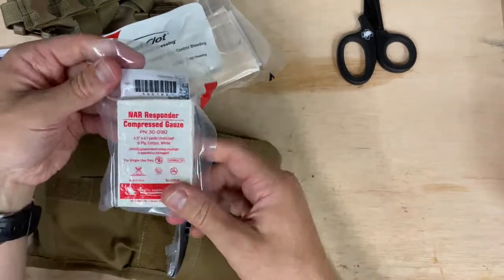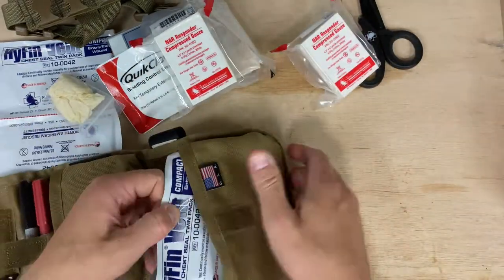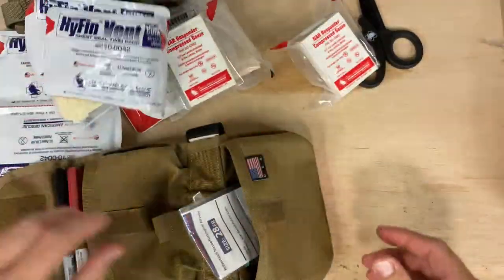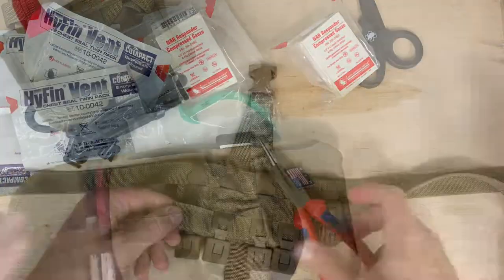Moving on to your second pocket: we've got two compressed gauzes, more chest seals, and then you've got your 28 French. And that is it.